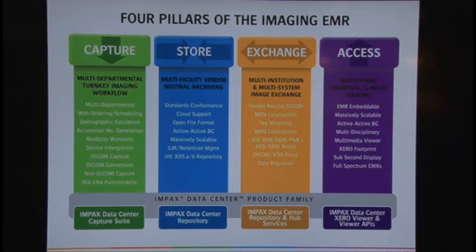The exchange pillar provides for services for the exchange of data between systems and other medical imaging institutions. And the medical imaging repository must provide services so that you can exchange data efficiently between dissimilar systems through things like medical record number localization, tag morphing, and providing general vendor neutrality.